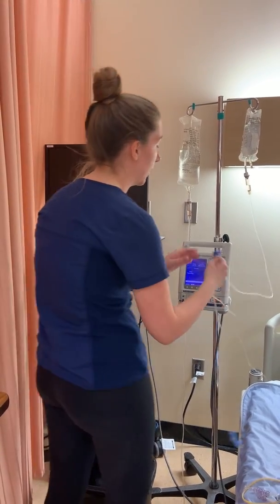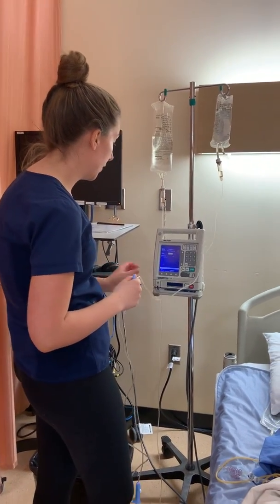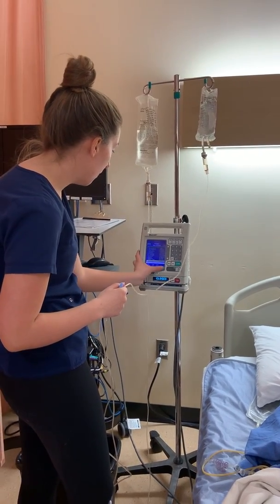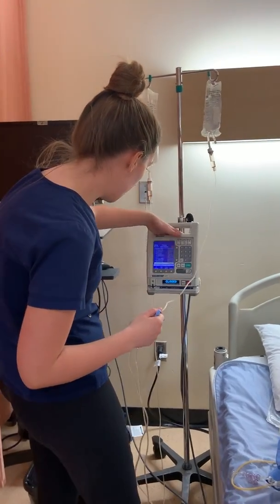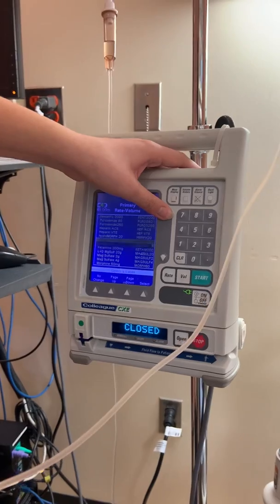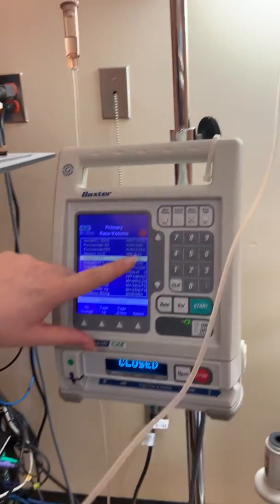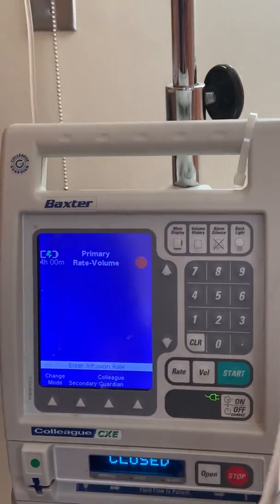At this point, I can now set up my Colleague Guardian pump. So I'm going to go to primary to start. I'm going to select Colleague Guardian. Now I'm going to page down. And I'm going to find the heparin. Now I'm being sure to select heparin VTE because my patient's receiving it for a blood clot, a thromboembolism, not for an ACS, so I'm going to select.